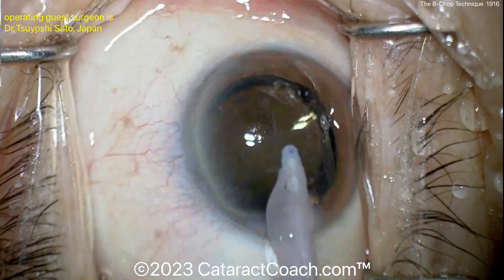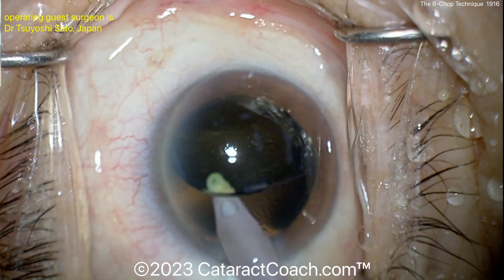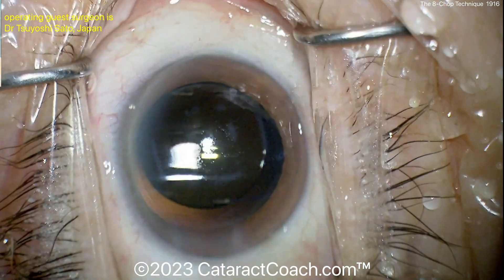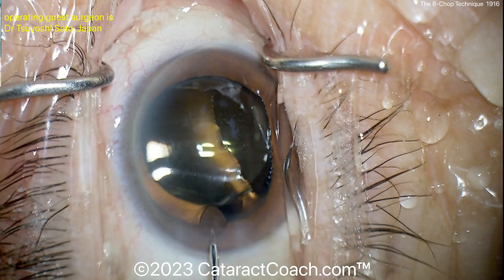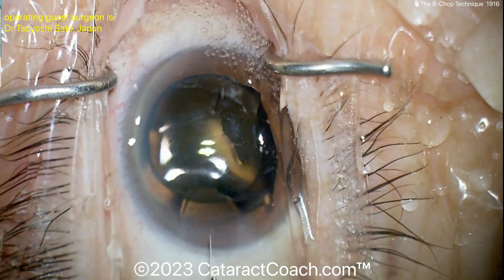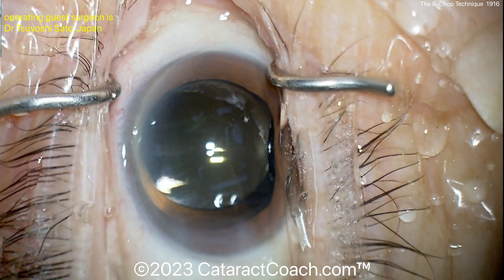This video is pretty much real time, and this surgeon is obviously very adept at using this technique — nicely done. I want to know your comments: are you used to using this technique? Do you use a pre-chopper? At the end of the case, loosening the speculum — that's an interesting technique. More BSS going in the eye and then hydrating the incision. Let me know below: do you use this technique, have you tried it, are you interested in trying it?